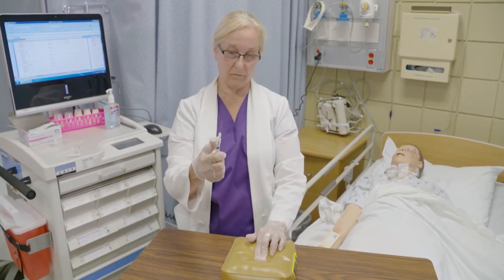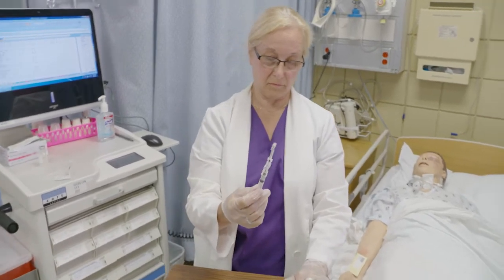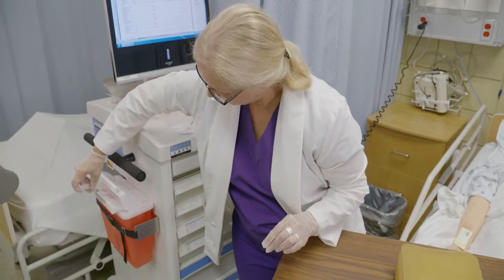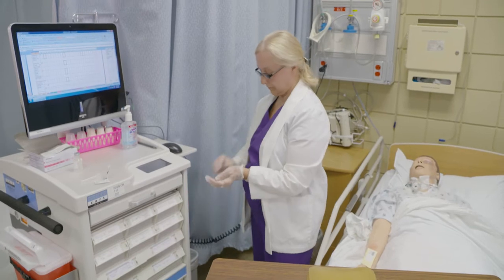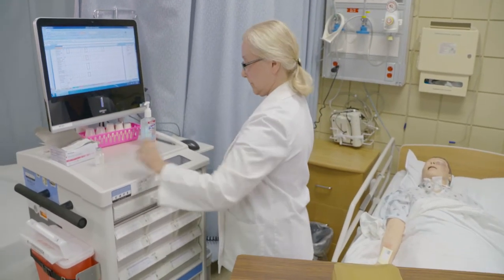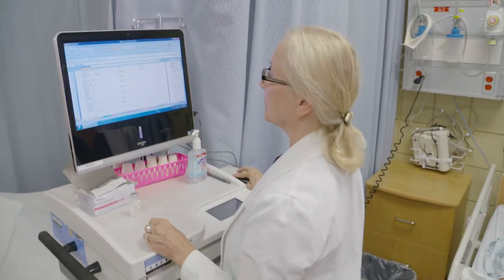Activate the safety guide using your thumb to cover the needle. This prevents you from being stuck by the needle. Discard needle into needle sharp container, putting the needle end first into the opening. Remove gloves, perform hand hygiene, and document both of the medications given.